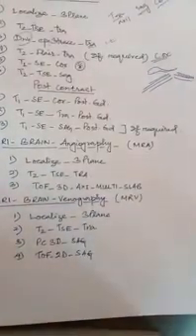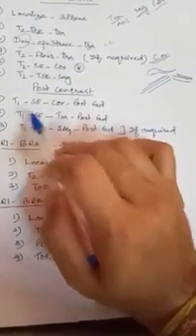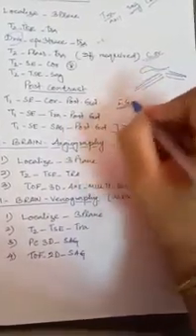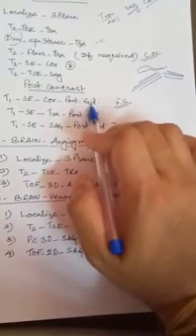If we need the contrast sequence, then remember one thing, for contrast we always use T1 sequences. T1 FS means fat saturation, fat suppression. That means we have to suppress the fats, and we are using the T1 spin echo sequence. After post gadolinium, the contrast we are using in MRI is gadolinium.